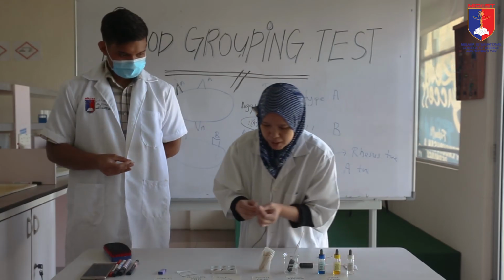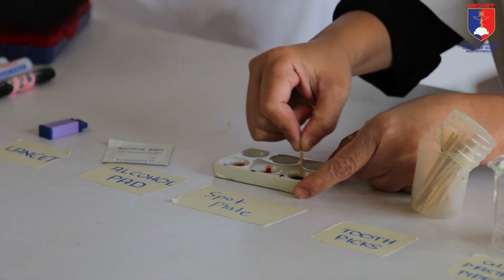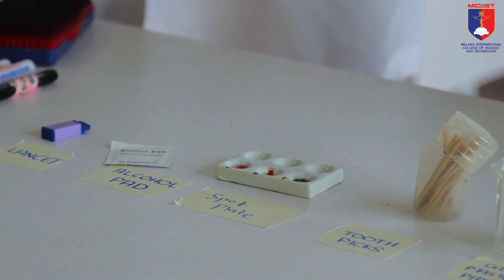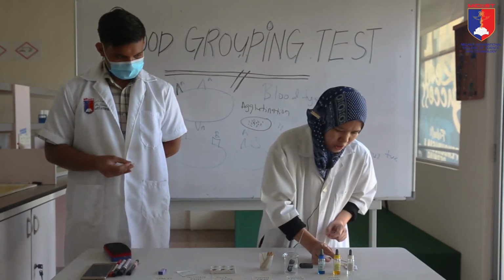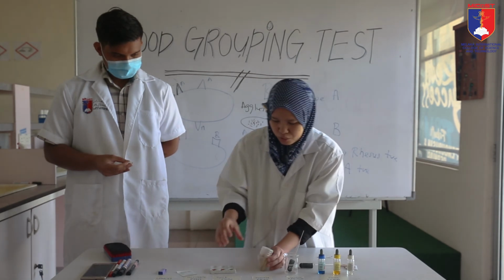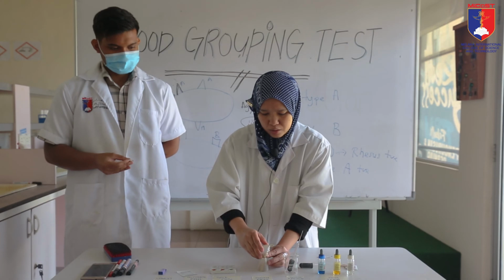Make sure you don't mix the toothpicks. Okay, and we leave it for 2 minutes, a few minutes to see whether there is agglutination or not.